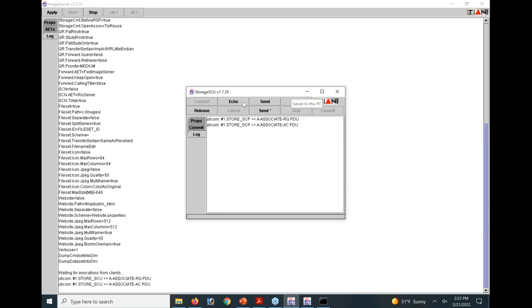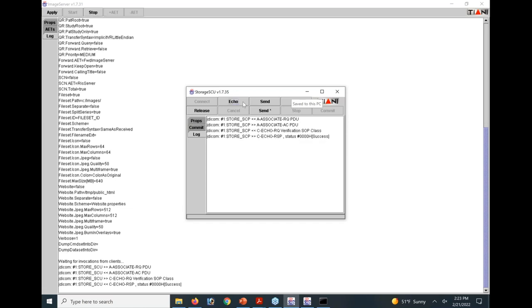Now, what PDUs have happened so far? Go back to our PDU list. 1 and 2. So that's PDU 1 and PDU 2 right there, right? Now I hit echo, verification request, verification response. What PDU would that be? 5 and 6? No, that's release. Never mind. It's back to 1 and 2 again. That's 4, that's data. That's not actually part of the handshake. The handshake was already done.